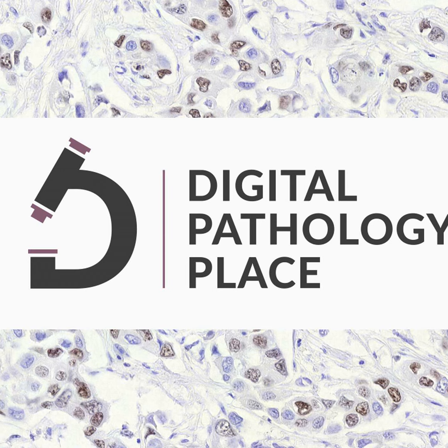So if we have an approach with handcrafted features, which in the case of lymphovascular invasion, maybe I would define a vessel, a cross-section of a lymph vessel, or maybe a longitudinal one. I will basically define how it looks, give the parameters, and then I would need even less data than those 162 slides.